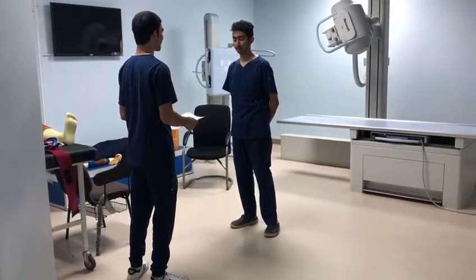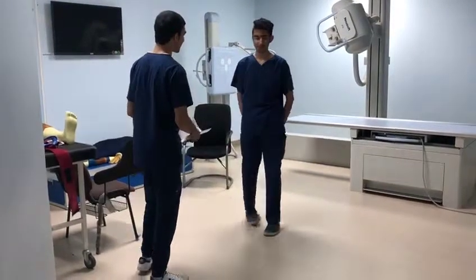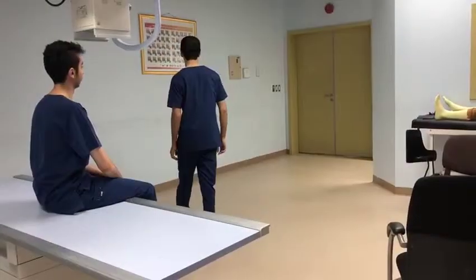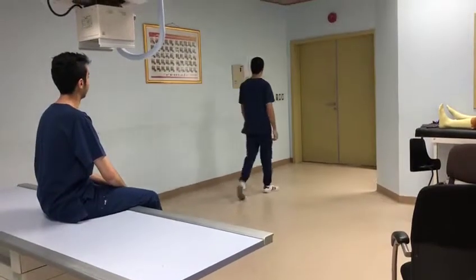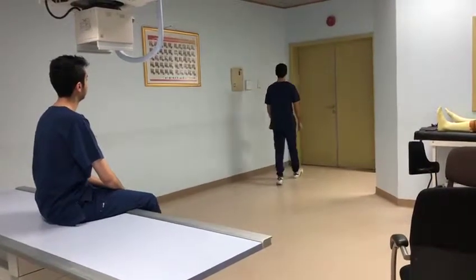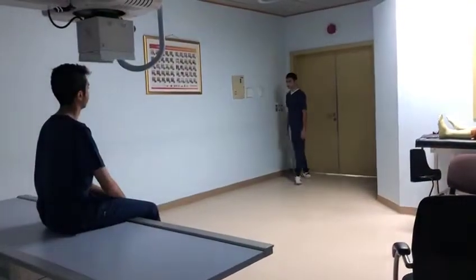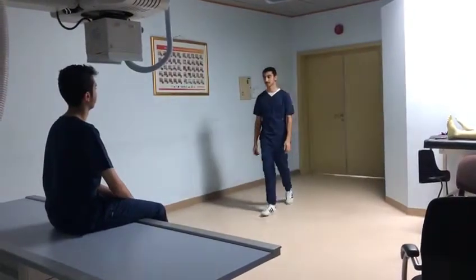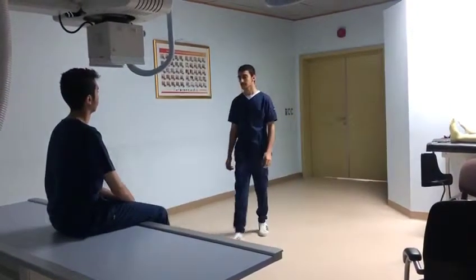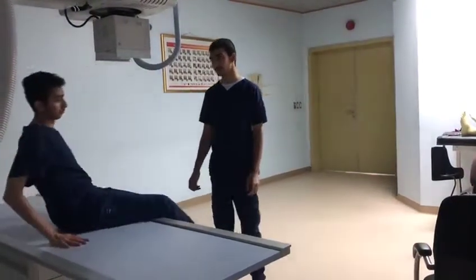Greetings. The technologist received a report about a patient who has abdominal issues. After welcoming, the technologist asked the patient a few questions, then told him to sit on the table.